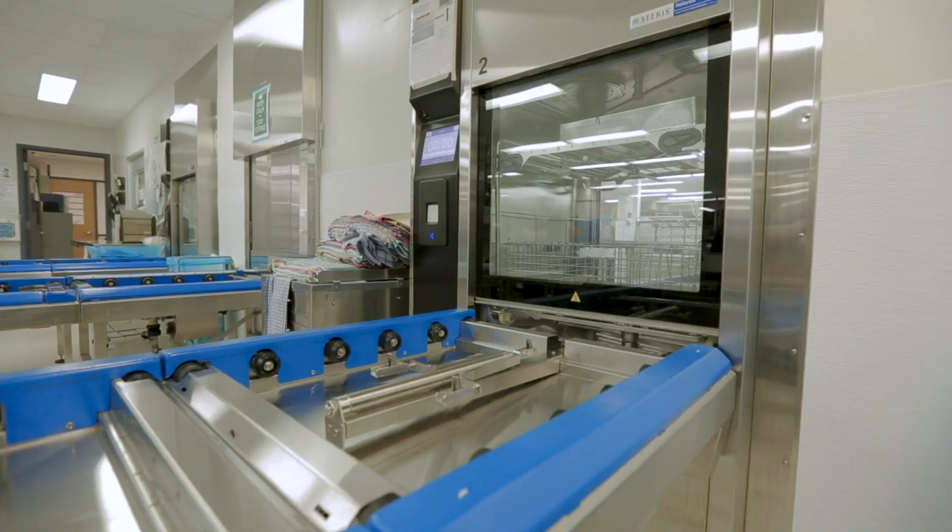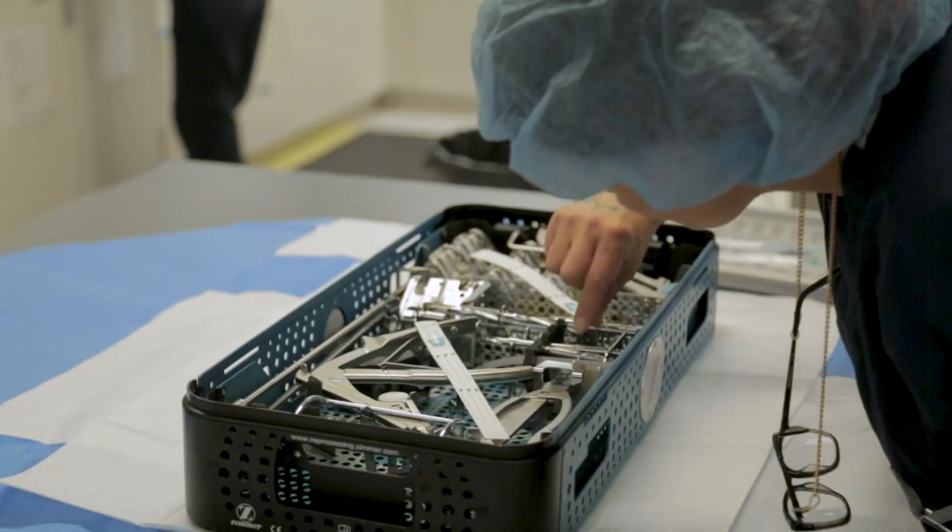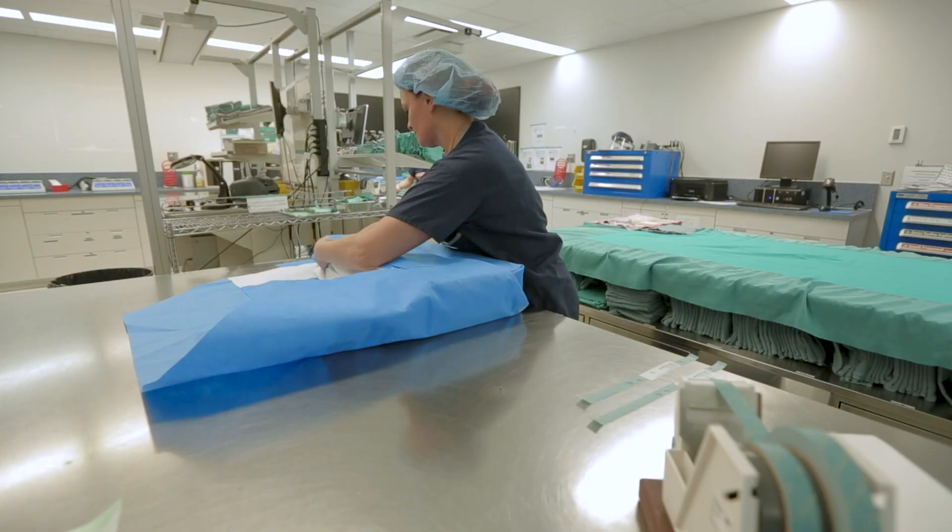We learn a lot about the students as they come through. One thing they've said is that it's great learning — you're in the classroom going through the books, learning all the steps, and then to actually come and be with us and see what they're learning from the books gives them a good insight of what MDRD really is with hands-on experience.